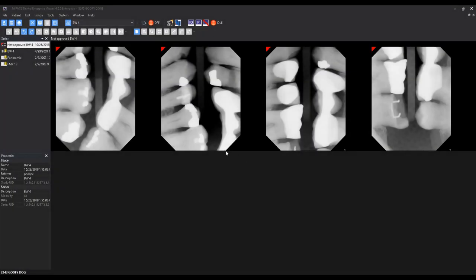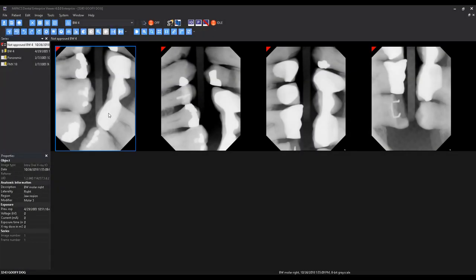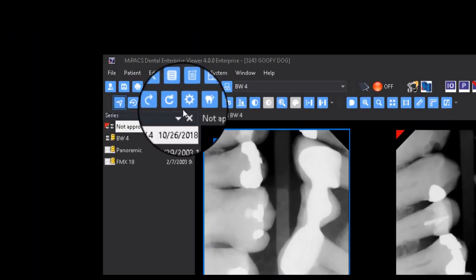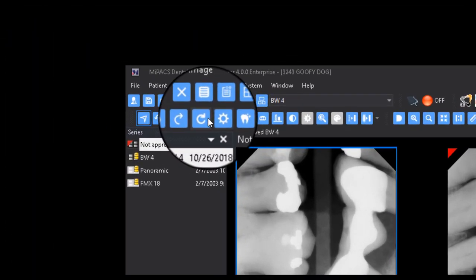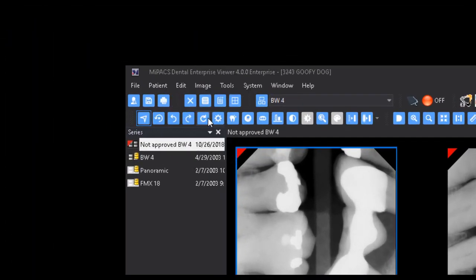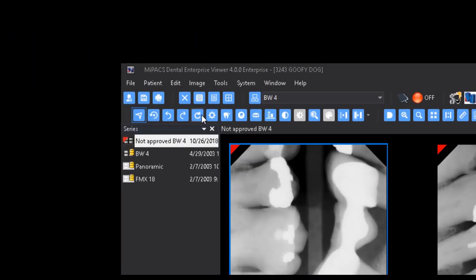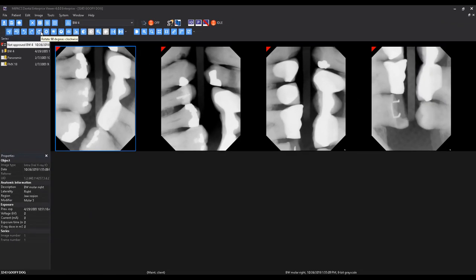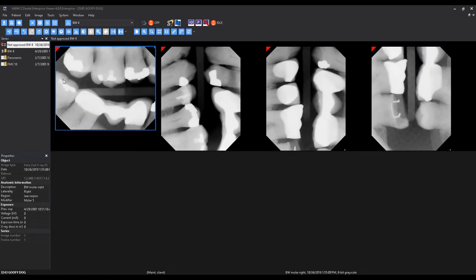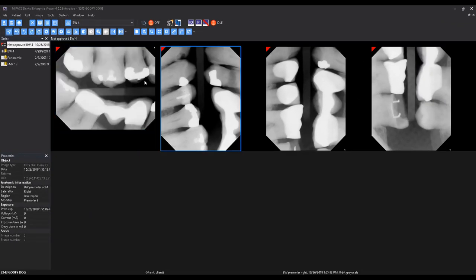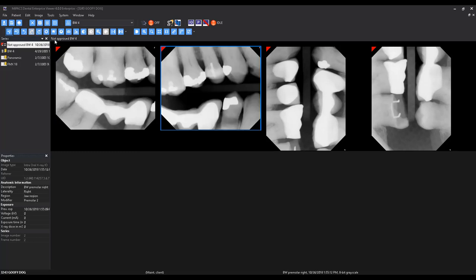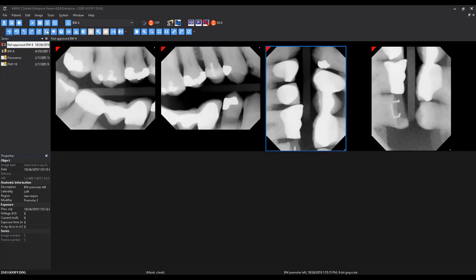To rotate an image 90 degrees, first left-click the image to select it. You will notice the border of the image turns blue to indicate that it is selected. Next, click the Rotate button on the toolbar to rotate the image. You can then proceed to the next image by selecting it and clicking the Rotate button again.